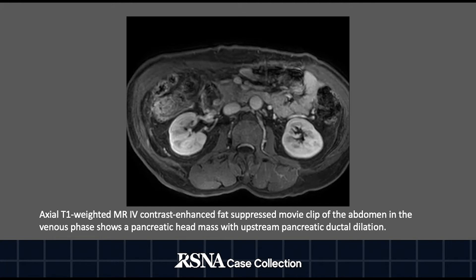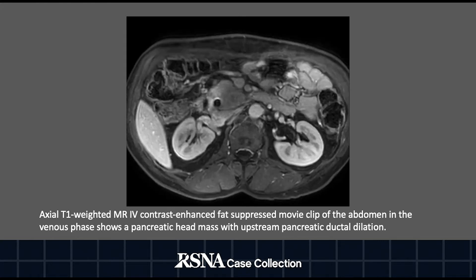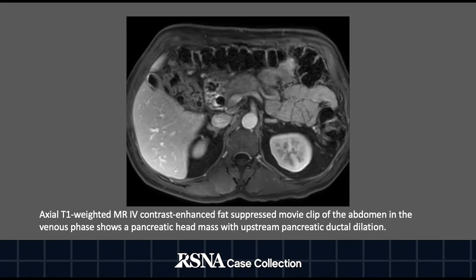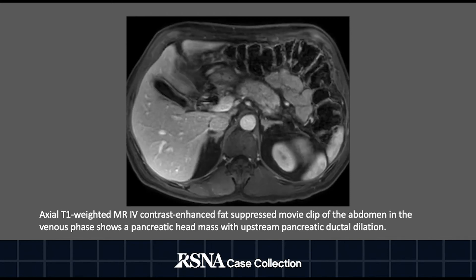Axial T1-weighted, MR IV contrast-enhanced, fat-suppressed movie clip of the abdomen in the venous phase shows a pancreatic head mass with upstream pancreatic ductal dilation.